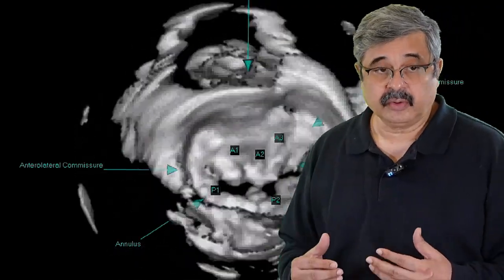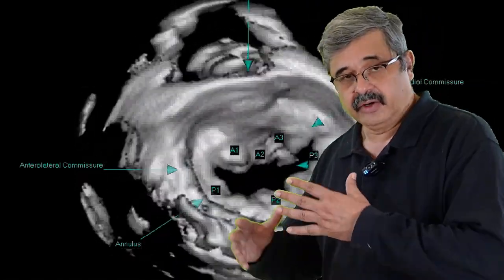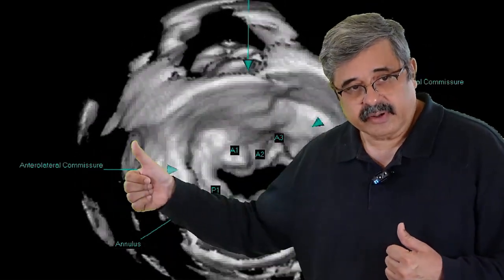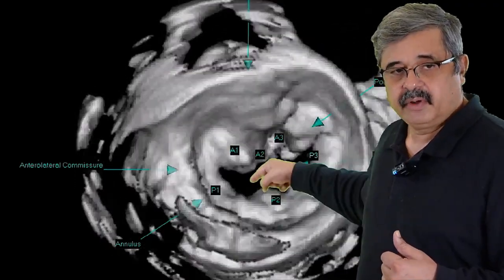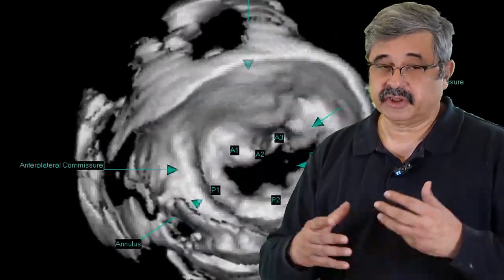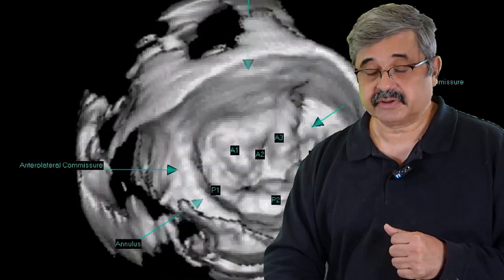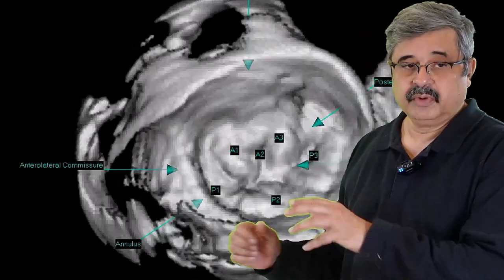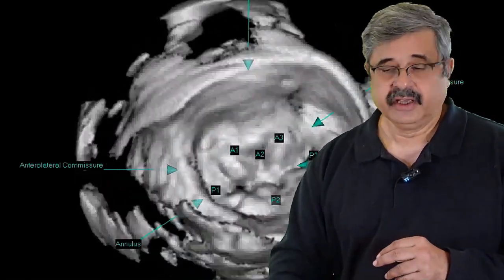When you got the image, it was actually a pretty decent result. You could display it in an anatomical format, and the machine — using landmark techniques and the earliest form of artificial intelligence — was able to label the valve components: the aortic valve, the left atrial appendage, A1, A2, A3, P1, P2, and P3. These were incredible earliest forms of three-dimensional imaging using AI based on landmark recognition. The images were good once you got them, though a little smooth and not as sharp because of the significant interpolation involved.